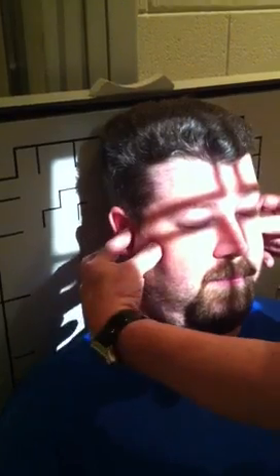And the area of interest is going to be the zygomas, because from here to here is zygomatic arches, and you can see where the crosshair, the shadow is going right through the zygomatic arches, right here. It's a lovely thing here. And if you want, you can actually probably collimate down just a tick. Kind of increase that recorded detail thing.